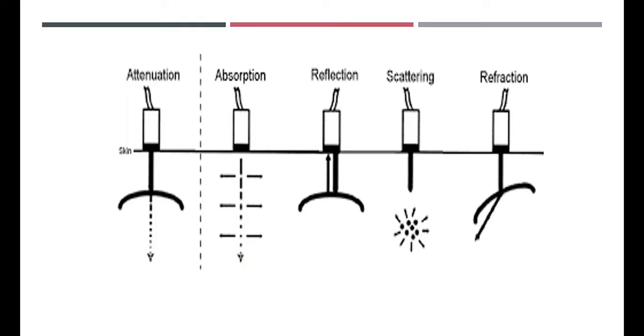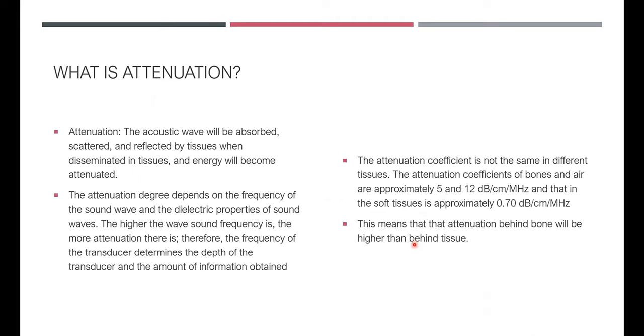Scattering is a very, very important concept. What it means is that when you have lung tissue, and this is the pleural margin, with sound waves coming through it, but it has fluid, and fluid occurs in the form of very small bubbles in the interstitial spaces. As we know, we talked about fluid being a very good reflector. When these bubbles, which are less linear compared to the pleural margin, reflect, they reflect in different directions. We call this scattering. When you reflect in different directions, if you have fluid all the way around, you'll have reflections in between the fluid particles as well. And this is what helps us generate B lines. I'll talk about refraction a little bit later.